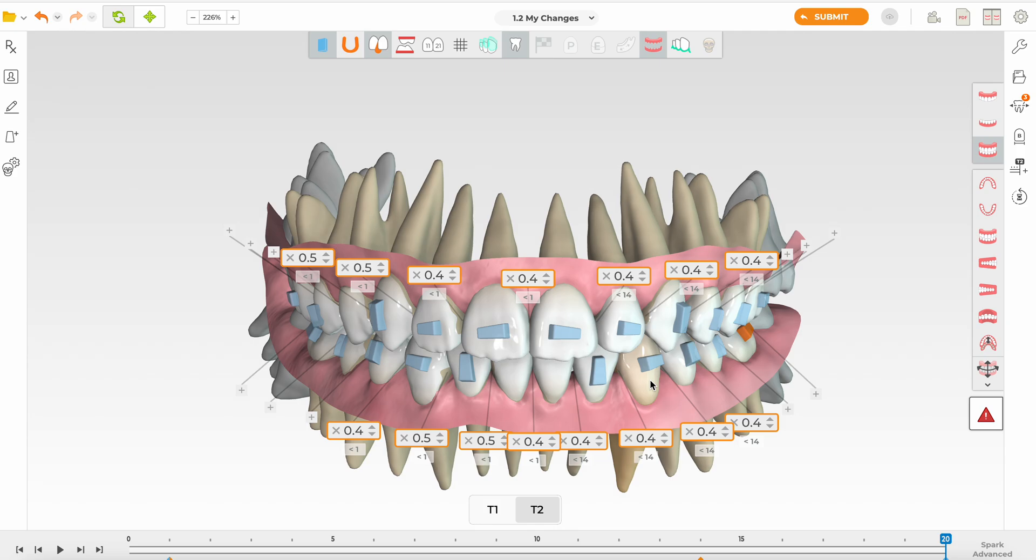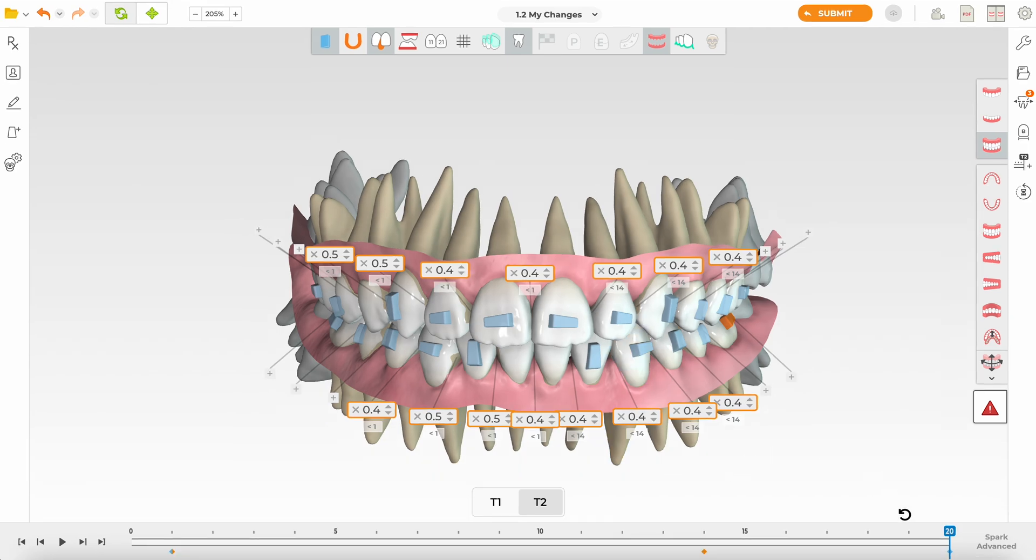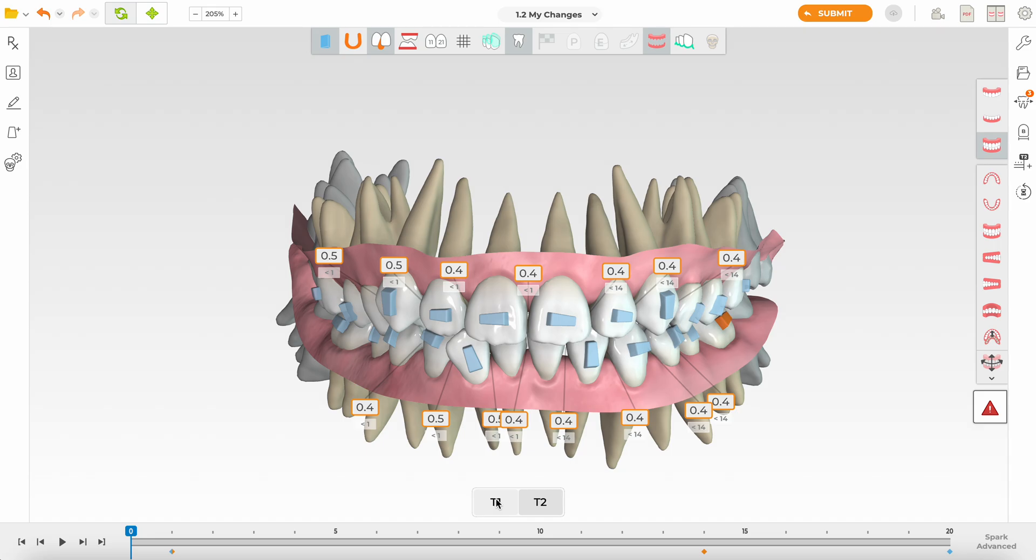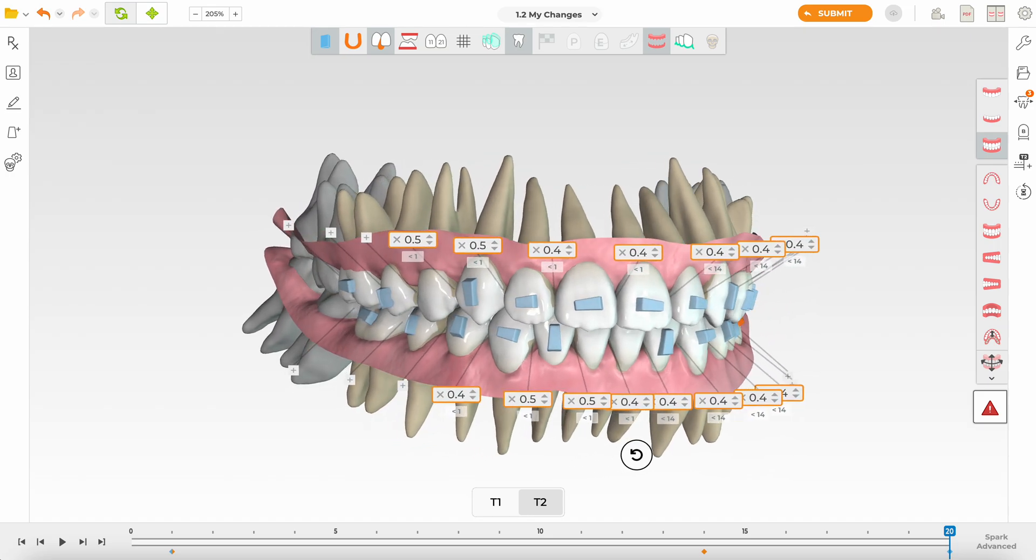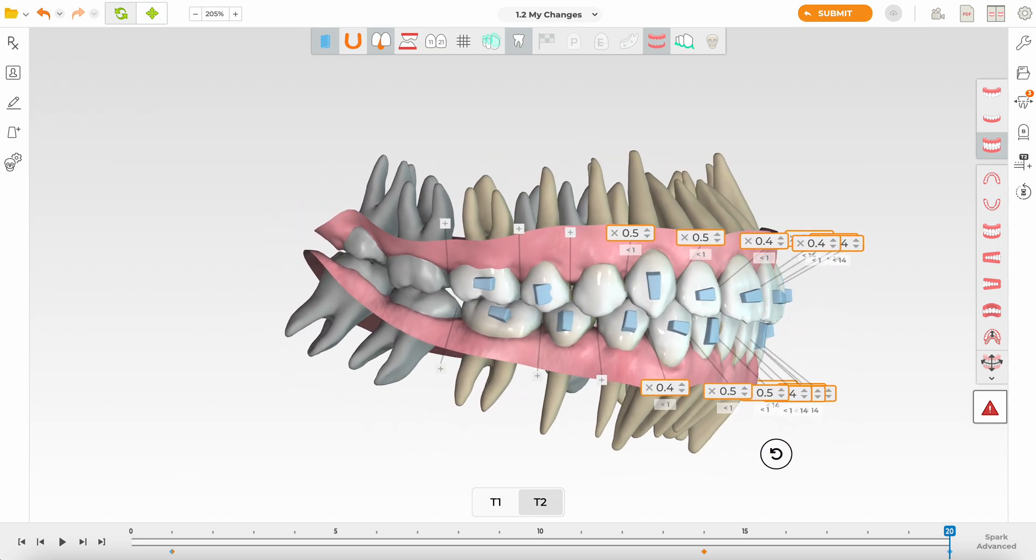Lastly guys, the 20 aligners is way under for this type of treatment. If we're looking at an adult we want slow progressive optimal movements based on the periodontal health and I can tell you right now that having this 20 aligner do it all magically is impossible.